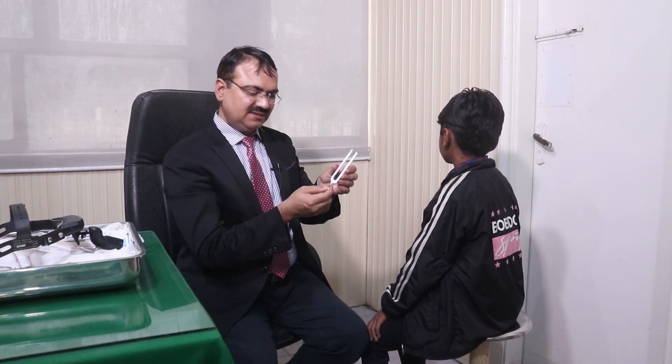This is the tuning fork test we want to perform on the patient. We are using 512 Hertz. We have to perform the test on both sides — the right side and the left side — and we have to compare. We will do Rinne, Weber, and ABC tests.